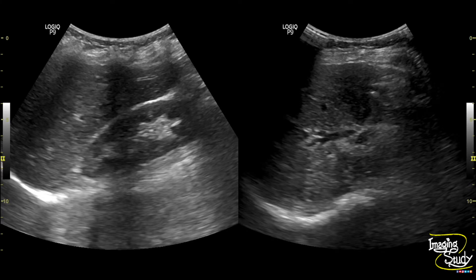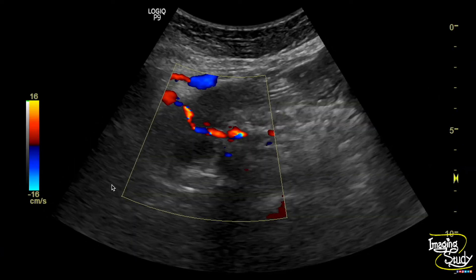Here is the picture of the liver showing the coarse hepatic parenchyma and dilated biliary tree. These are the blood vessels which are getting displaced by the mass.